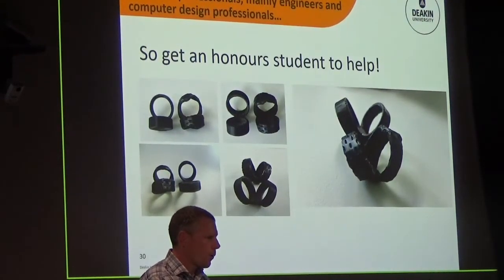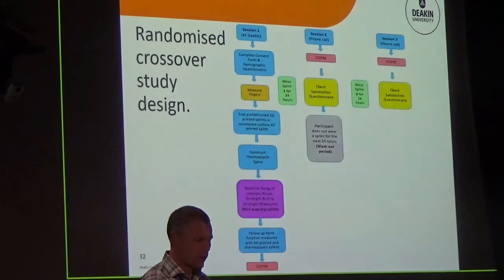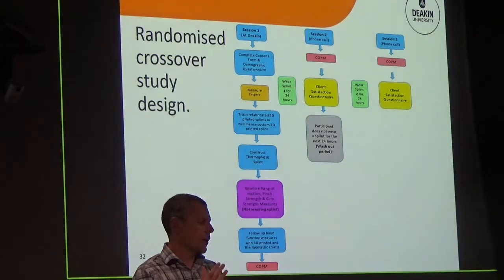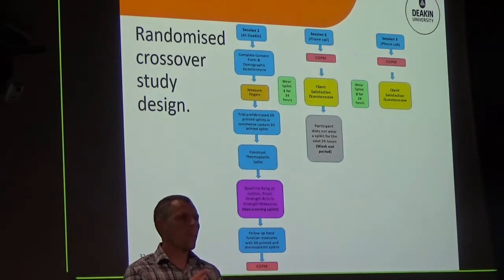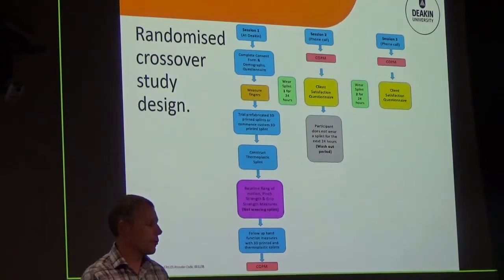And what Amelia and I went through is 12 months of collecting some data, gained ethics. We were aiming for 15 people, ended up with 25 Deakin students and staff. The process was basically they came in for a session, did the whole consent thing. Again, I'll go into much further detail of this at the conference. But basically they came in, did some baseline measures. I did a measurement of the finger, printed out a splint as per the measurements. And I moulded a splint to the person's finger at the same time, and that was my work done, and then I left it to Amelia to do the rest.